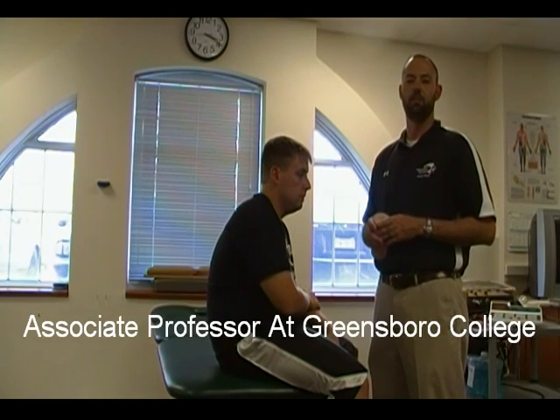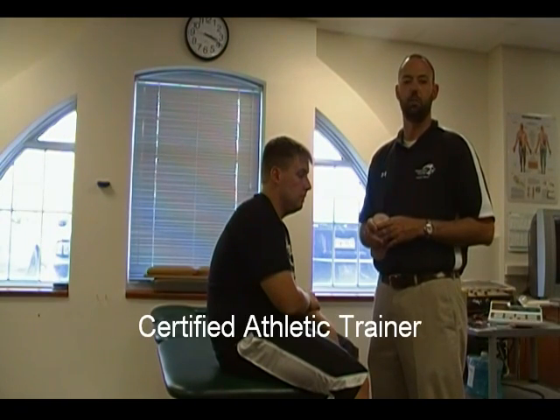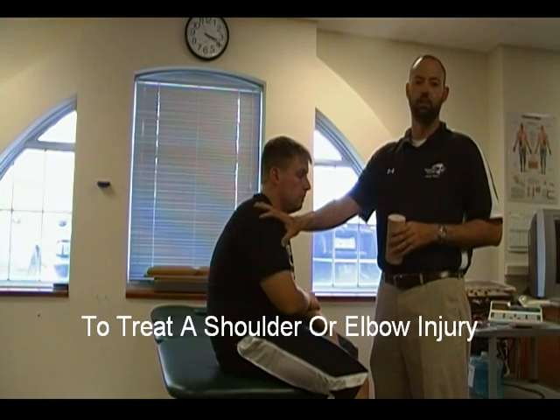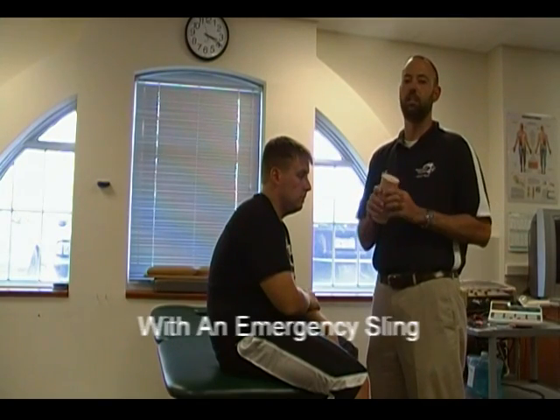Hi, I'm B.C. Charles Luskin, Associate Professor of Athletic Training at Greensboro College. Today I'll be demonstrating how to use a 6-inch double-length elastic wrap in the treatment of a shoulder or an elbow injury in which I need to create a sling.